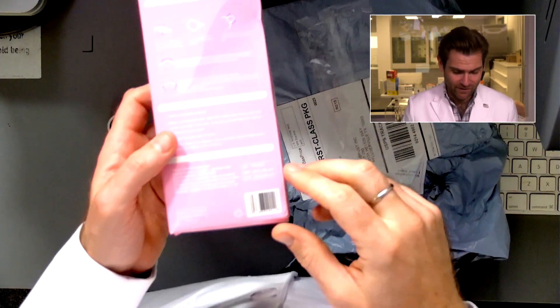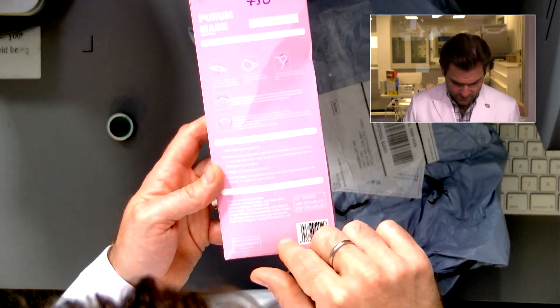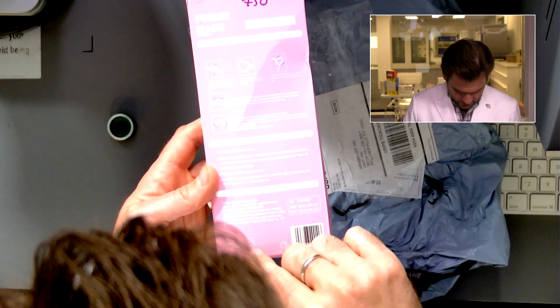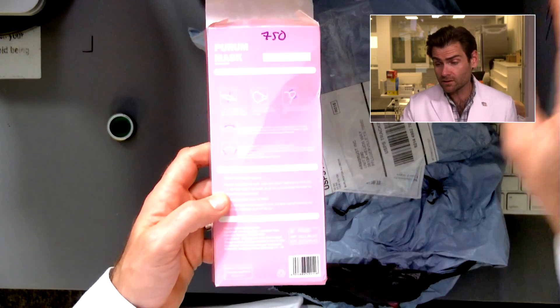Not a KF94. KF94s have to be made in Korea — it's part of the standard. If you look on here, you can see that it's made in China. And it's using the executive standard GB2626-2006, which is the KN95 standard.